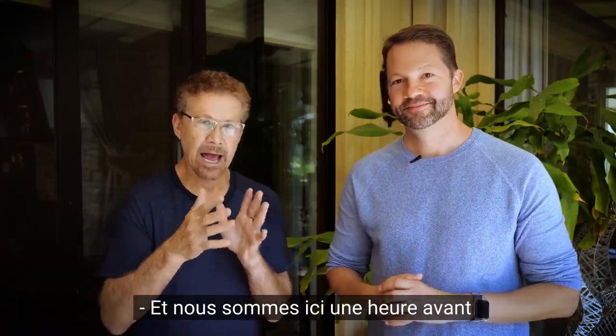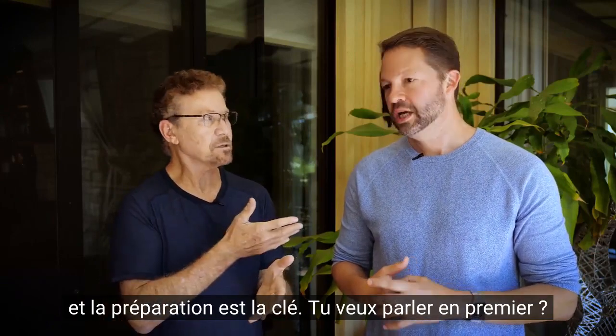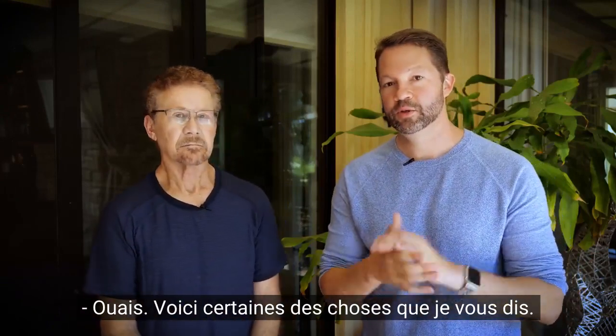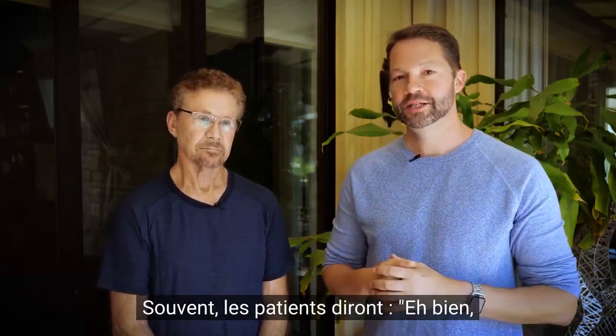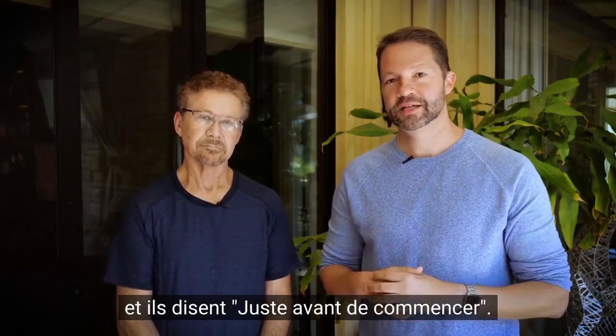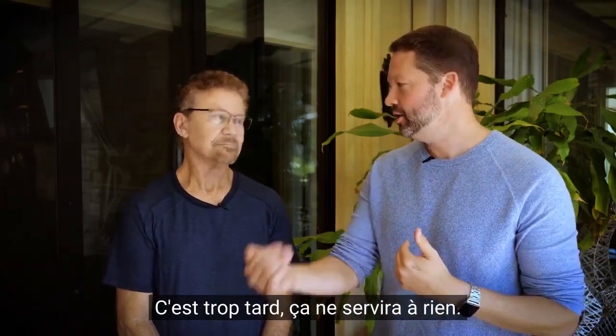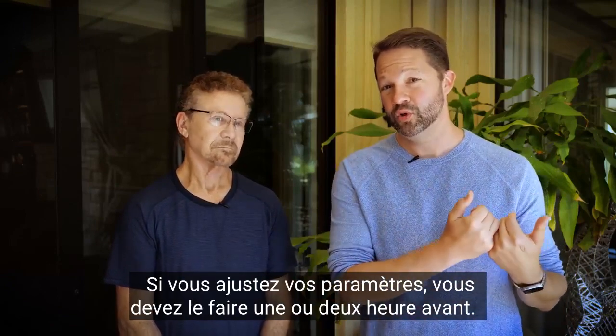Yeah, and we're here an hour before, and the preparation is key. You want to go first? Yeah, so here's some of the things that I tell people. You really have to prepare an hour or two before. A lot of times patients will say, well, I adjust my basal. And I say, well, when do you do it? And they say, well, right when I start exercising. Way too late. It's not going to do anything. If you're adjusting your settings, you really need to do it an hour or two before.